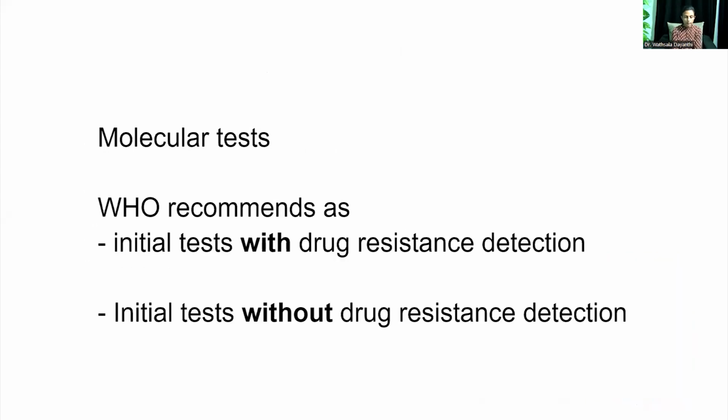So this is the molecular test, or the newer rapid test, I'm going to discuss in detail. So WHO recommends doing this molecular test as the initial test to increase the case detection and to increase the sensitivity of the test. So they can be categorized as tests with drug resistance detection and without drug resistance detection. It's mainly rifampicin.